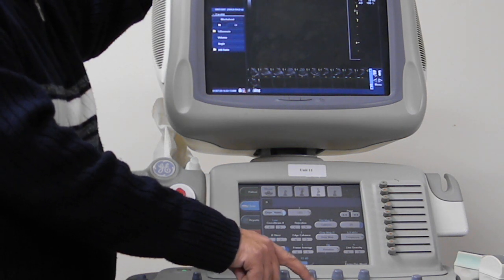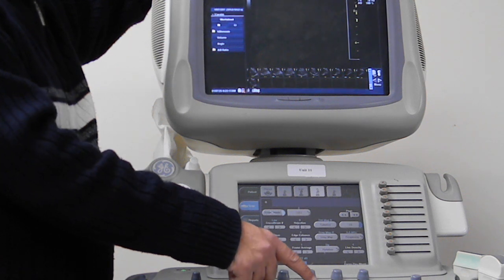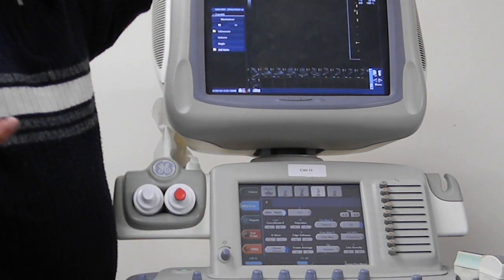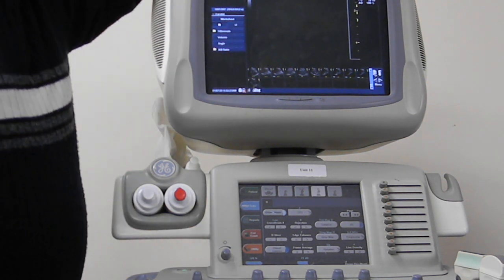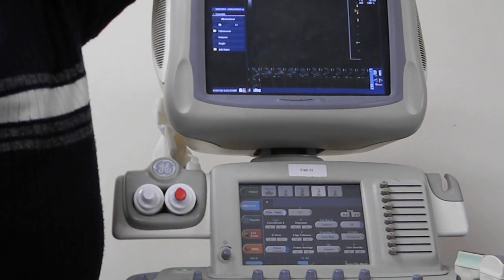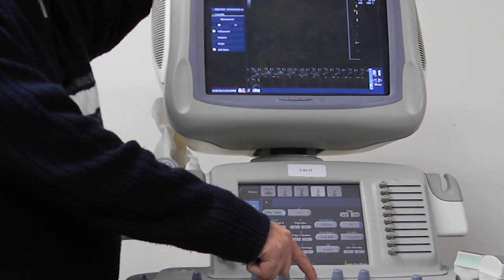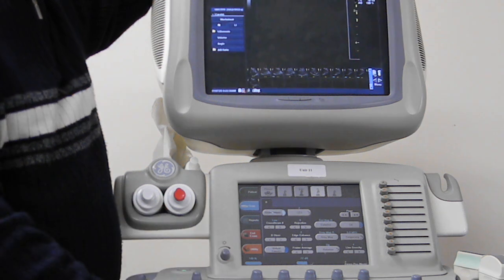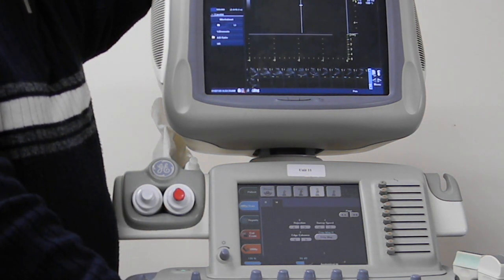Right now this is off, because we see a yellow light. How do we turn this on? This is one of the functions that can be turned on and off, and we just press. And here we go.